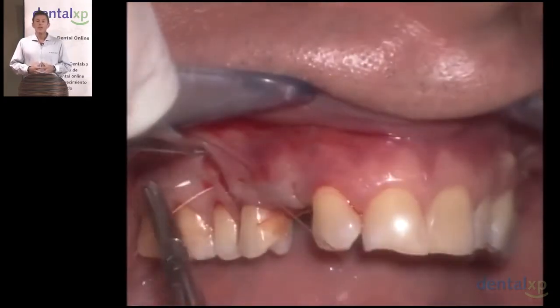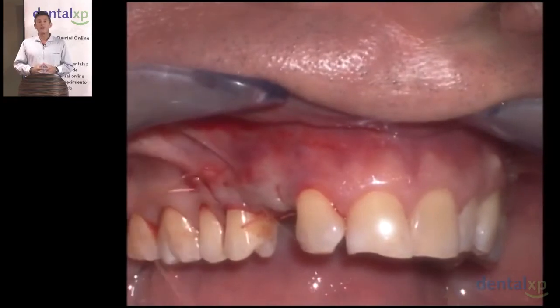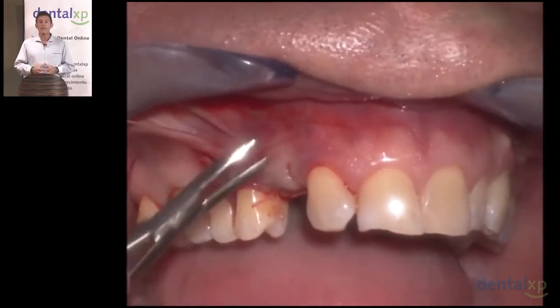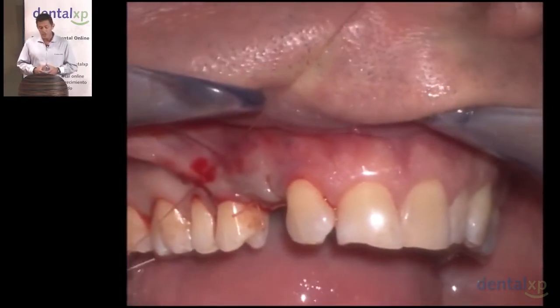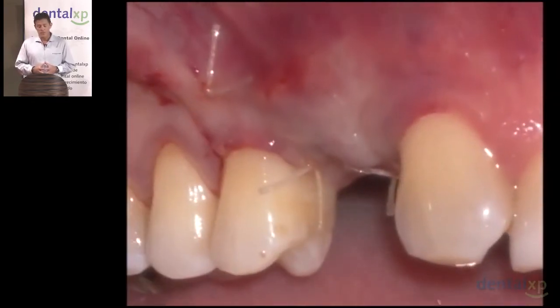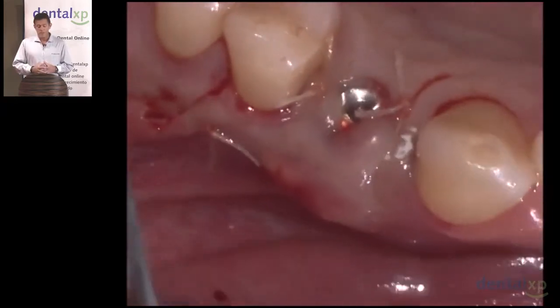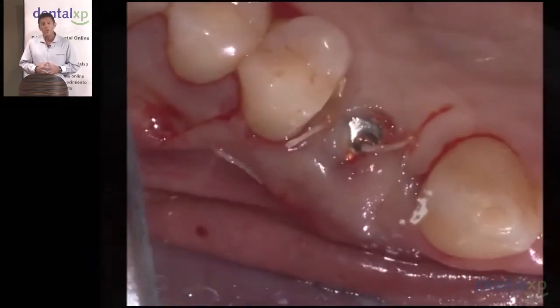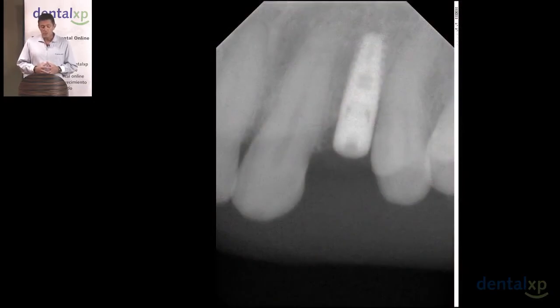Remember again that the only reason we are able to do this simultaneously is the reverse engineering aspect of this protocol, which is to first address the placement of the implant, scan it and send it to the laboratory, and only then address the regenerative aspects of this treatment. Here you can see just 3 or 4 sutures being placed, a minimally invasive surgical protocol. Here's the healing abutment peeking through the soft tissues. And here you can see from an occlusal view how that looks on the day of surgery.